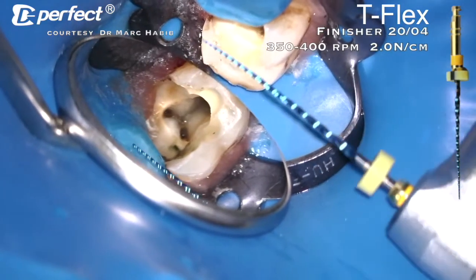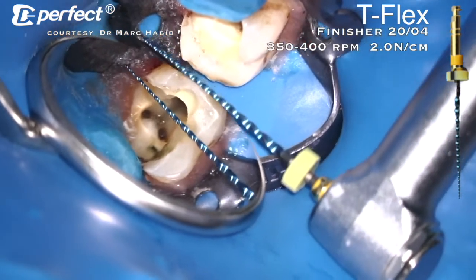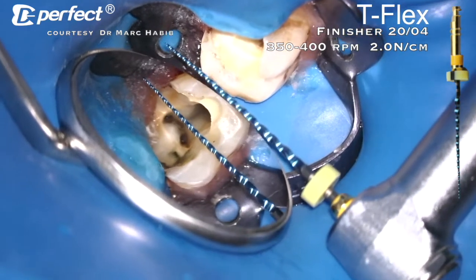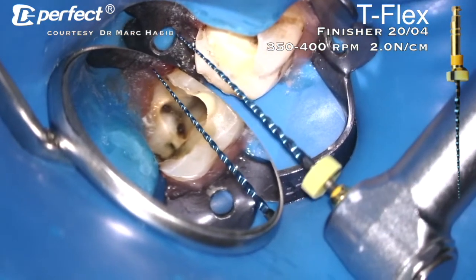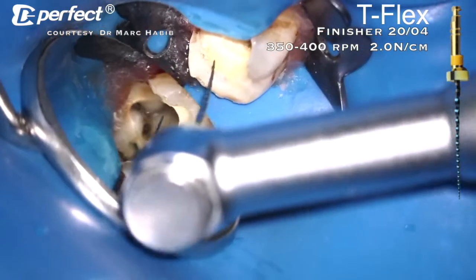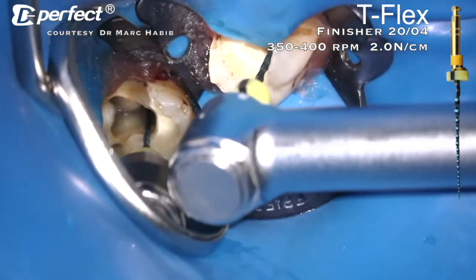The first shaping file is the Finisher with 20 tip and 4% taper. This is the yellow ring file. So we are preparing all 3 canals to the working length.